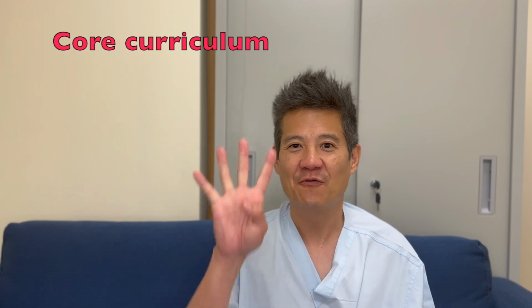Today is another core curriculum talk, ReverseCART 4, the last of the talks on ReverseCART. Well, maybe not the last, but the last for now. ReverseCART is a big passion of mine, and maybe I'll think of another talk to do sometime later on. But this talk really is about the ways we can complete ReverseCART quicker and more efficiently and more successfully.